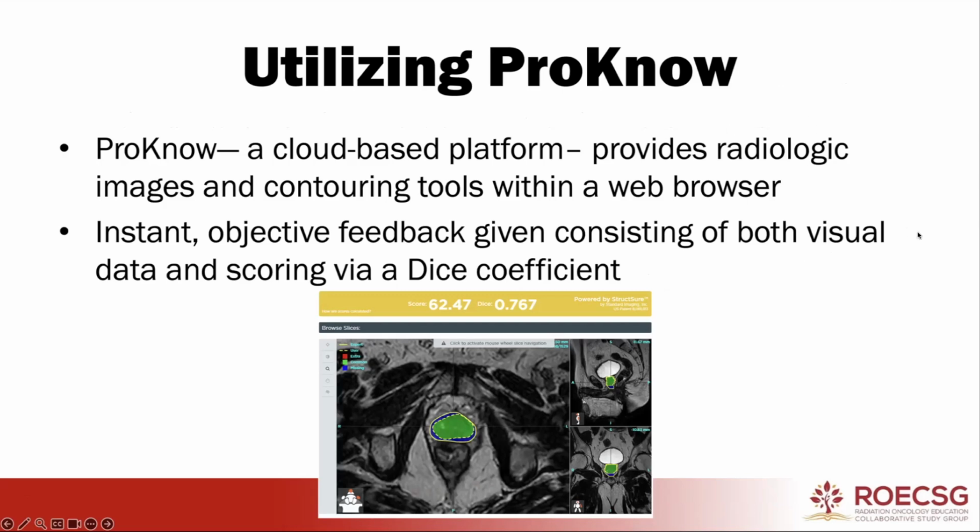And here is an example using a prostate as an OAR, utilizing this cloud-based platform, giving the score on the left and the DICE coefficient on the right, showing the green, that's commonality between the user and what they call the expert, which are many contours, generally how you would make an auto contour to become used, many contours compiled and then integrated.